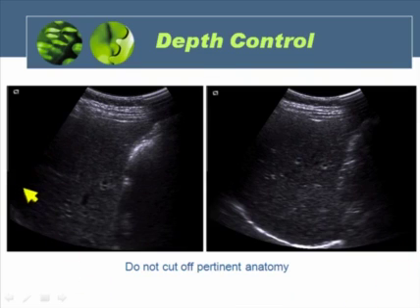Again, looking at this liver, notice that I don't see the diaphragm in this image. Therefore, it's possible that I'm cutting off pertinent anatomy. Looking at this image, notice we see the diaphragm. I know I'm not missing anything.